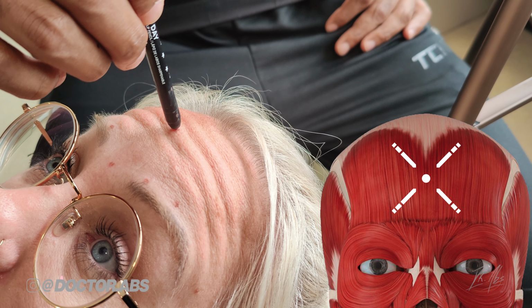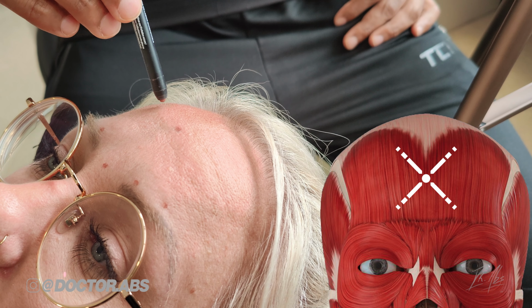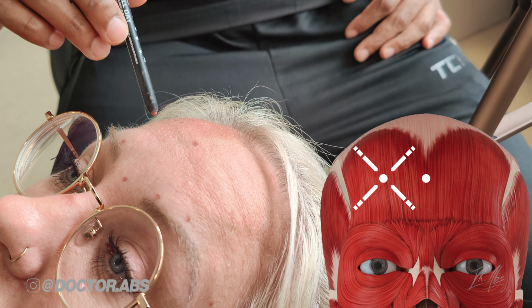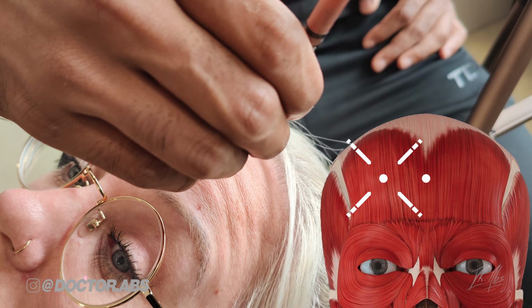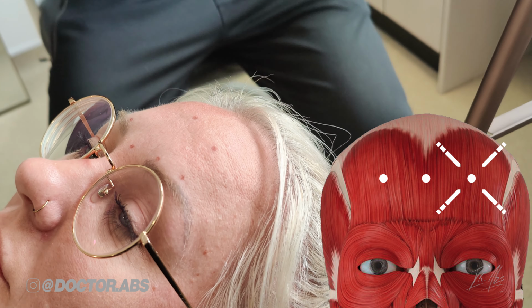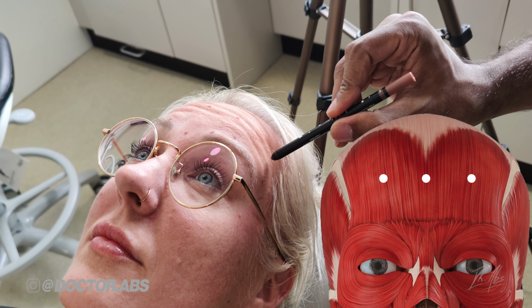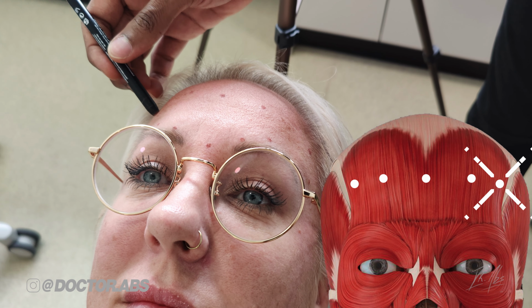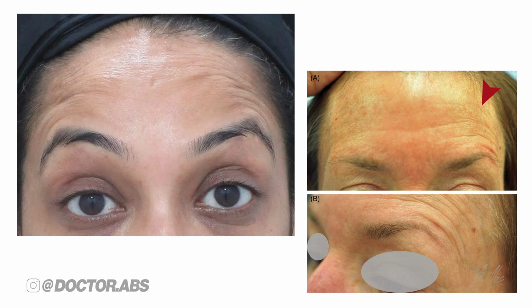Then we're going to try and find somewhere on the mid-left and the mid-right area for the second and third points. I'm working out where the majority of the muscular activity is by asking her to move and then deciding somewhere roughly there between the center point and the edges of the muscle. I also want the edges relaxed too though, because if you don't do this, the sides of the muscle overwork to compensate for the middle of the muscle turning off, and you get these ladder lines as well as high eyebrow peaks, sometimes called spock brow.